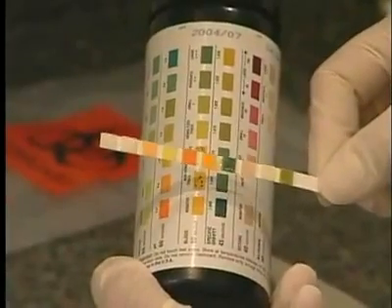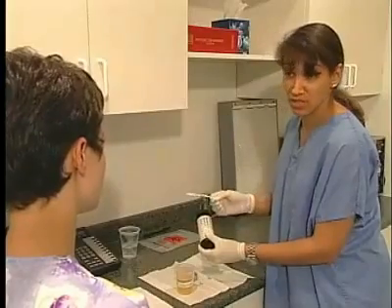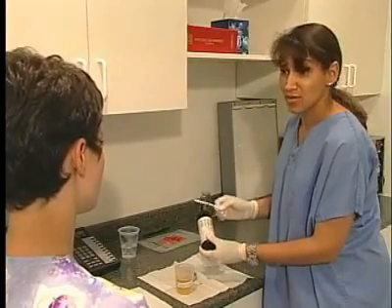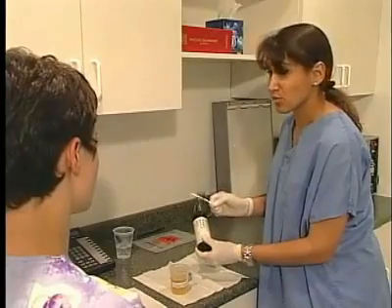Remember that the strip should never touch the side of the container when comparing it to the color chart, because this will contaminate the container. Also, the reaction times after you moisten the strip with urine are pretty short, but you'll have enough time to record your readings.